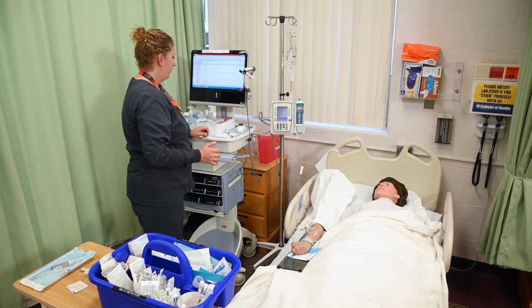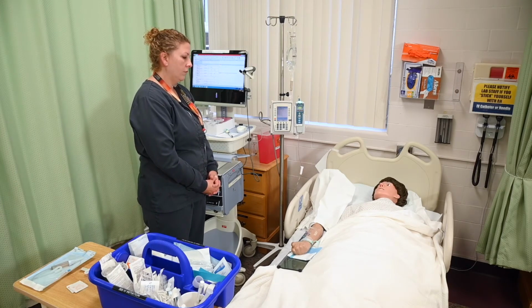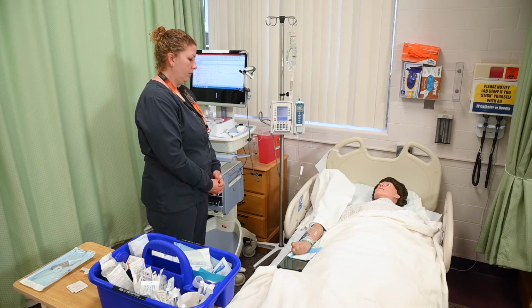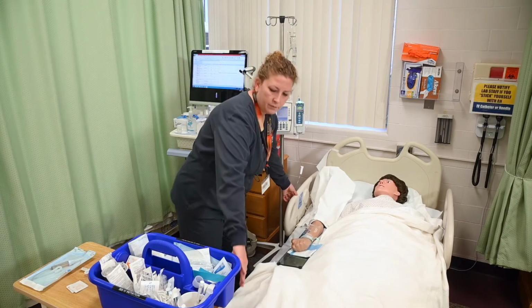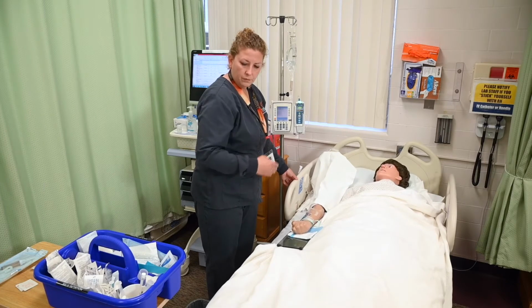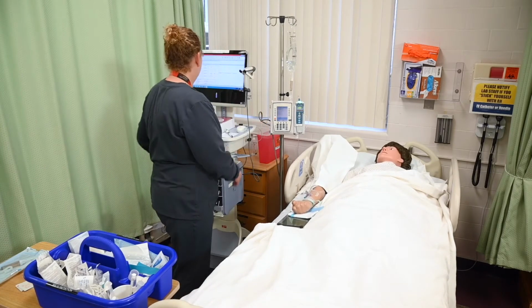Discuss with the patient the purpose of each medication, expected action, and possible adverse effects. Explain that you will give the medication through the patient's existing IV and allow the patient to ask questions. Raise the bed to a comfortable working height. I'm just going to raise your bed up, Ivy. Apply clean gloves.